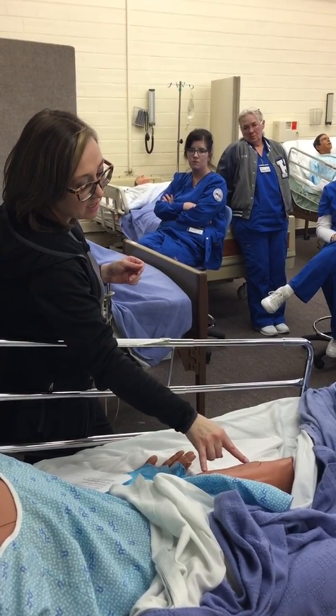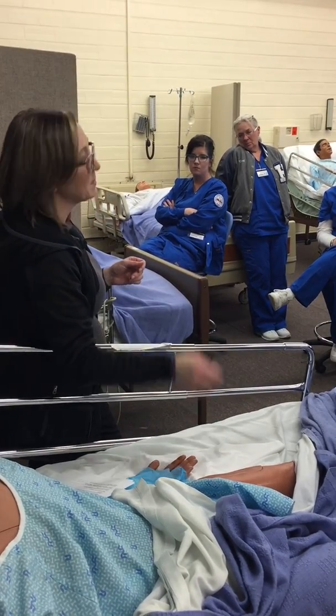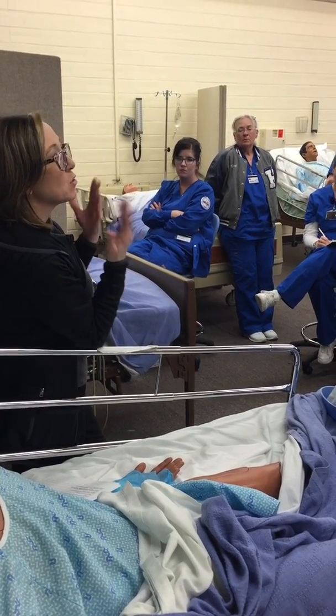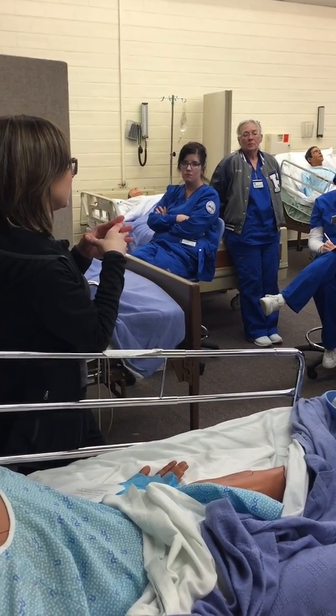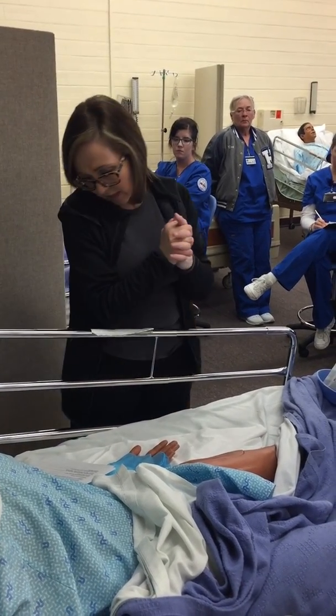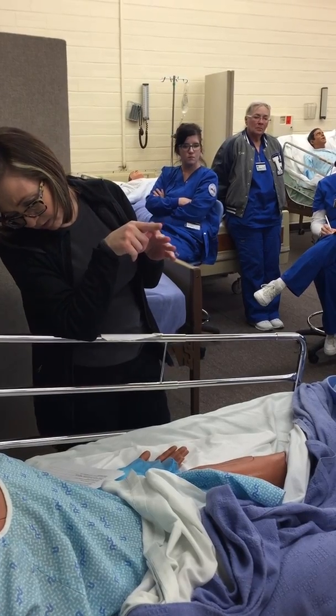So if I was to look at this, I would say it was a wound approximately 4 inches in length and approximately 1 inch in width. And make sure you document approximate, because these are approximations, they're not exact measurements, so you want to put approximately. That covers you, because it's an approximate thing. So we've done all that. Next thing we're going to do is cleanse the wound.